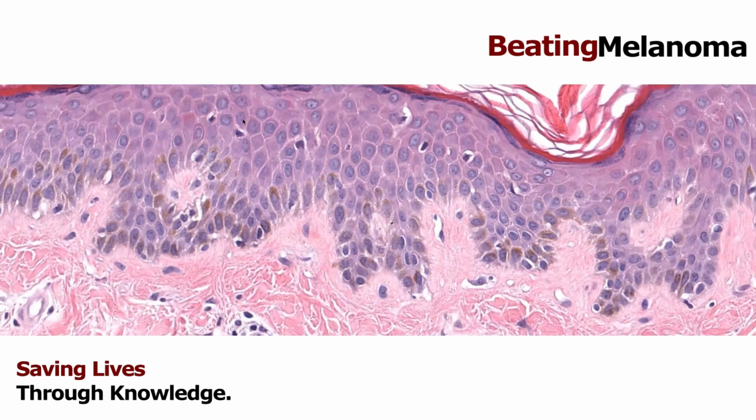These big purple dots in the middle are the nuclei. That's where the DNA is, and that controls all the functions of the cell. And then this pink, beautiful layer on top that looks like a little woven together basket, that's the top layer of the epidermis called the stratum corneum. That is made of keratin that's dead. Normally, it's supposed to be dead.